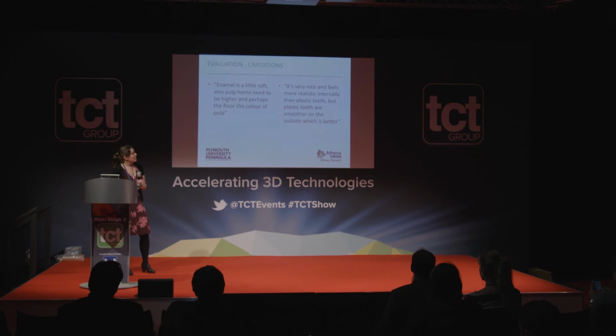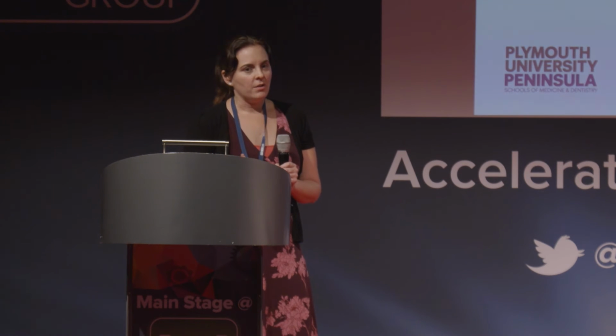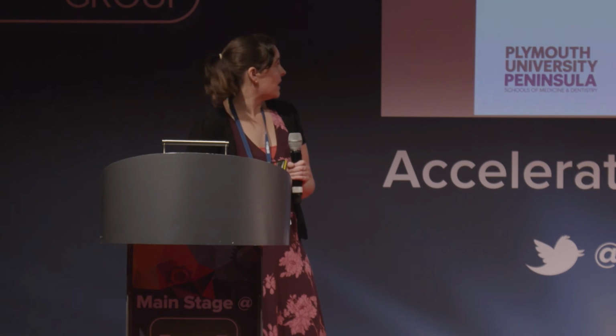There were some limitations, so the enamel part of the tooth is a bit soft. If you think about it, enamel is the hardest substance in the human body, so there are no plastics out there that could be 3D printed that are really going to be as hard as that. And the plastics that were available on this printer weren't as hard as that. However, the dentine, the pulp, the decay are all very realistic. So I'm willing to accept that the enamel isn't quite there yet, and perhaps there are different materials or different methods that we can look into to change that.